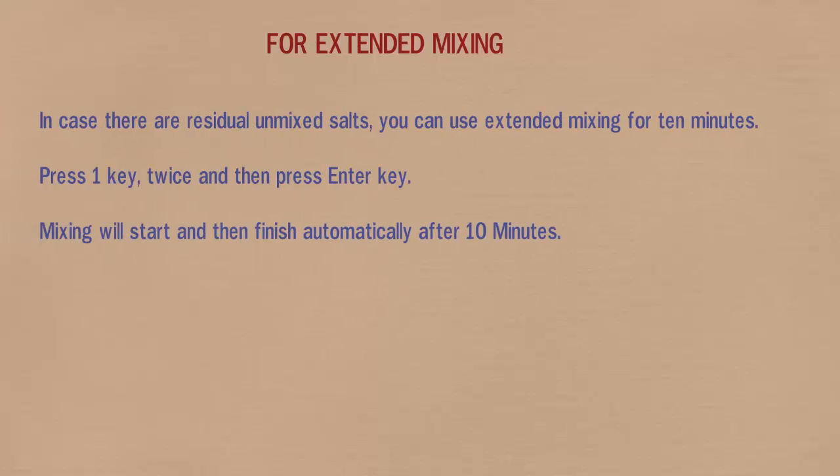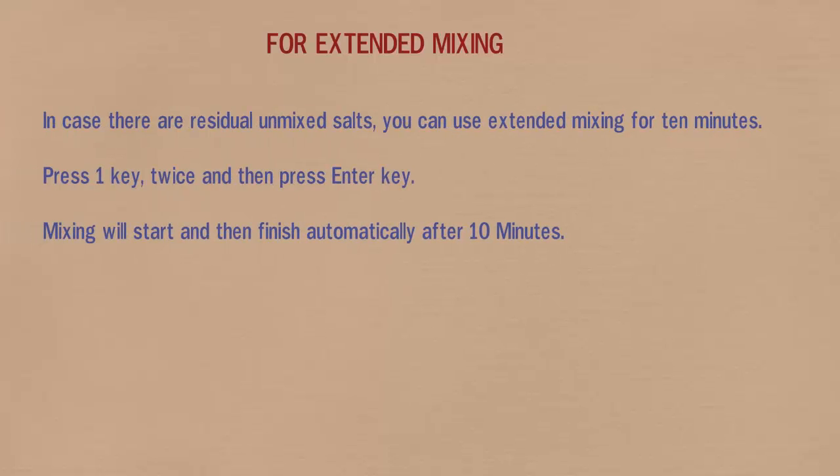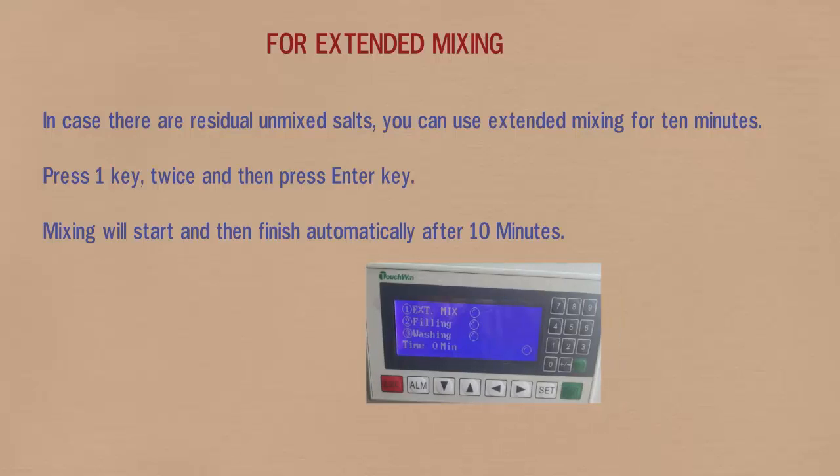Follow this for extended mixing. In case there are residual unmixed salts, you can use extended mixing for 10 minutes. Press 1 twice and then press ENTER. Mixing will start and then finish automatically after 10 minutes.